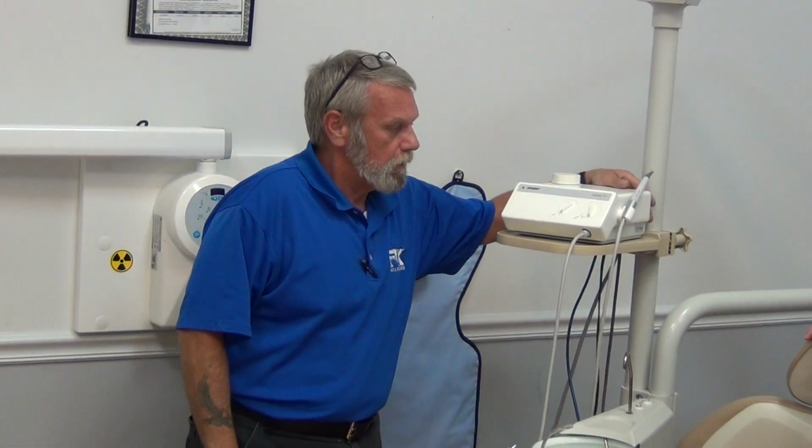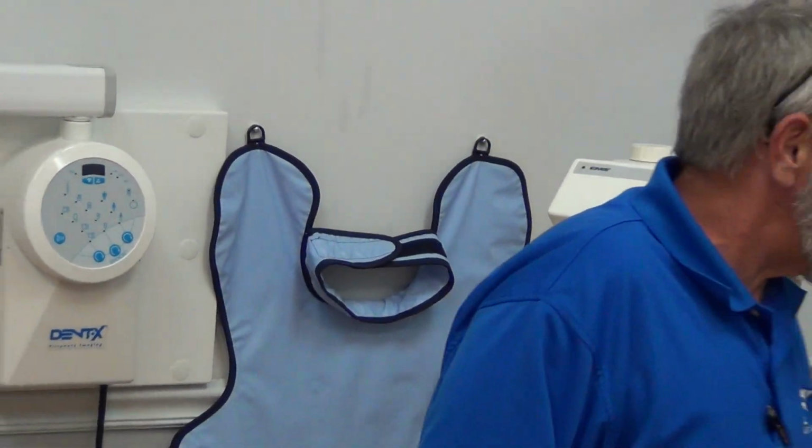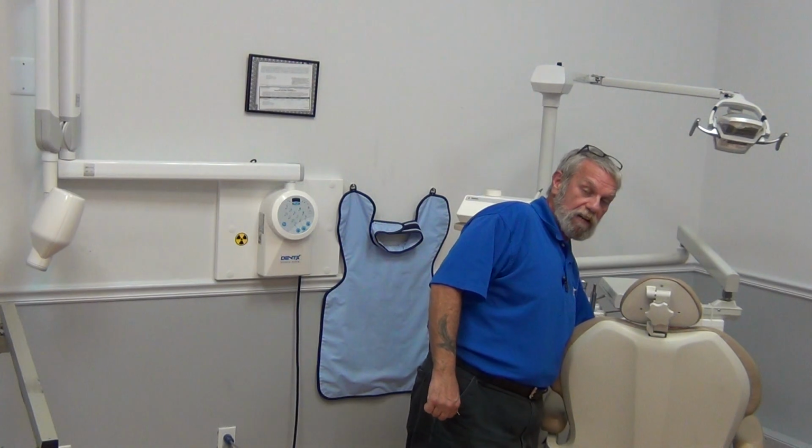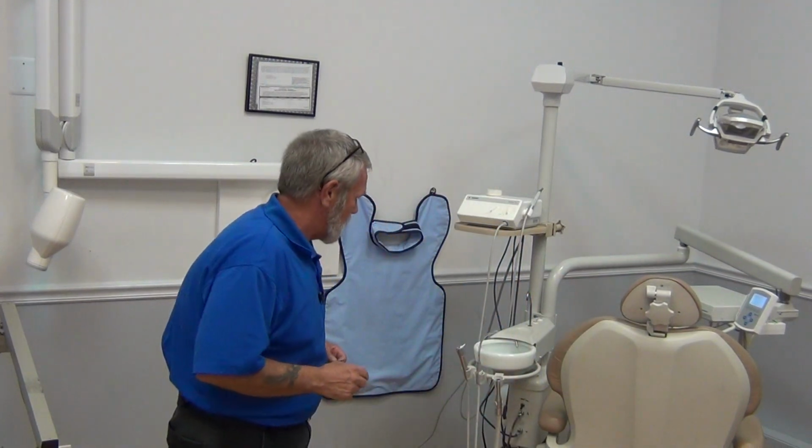Now, I still don't hear any hissing or any lights or anything coming on. What would be your next step to do logically? The logical next step is to make sure the master switch on your unit is on. Prophy jets and Cavatrons don't generate their own air and water. They have to have air and water from somewhere, and usually it's from the delivery system. So let's make sure the delivery system master is on. The delivery system master wasn't on. That's your second thing to check.